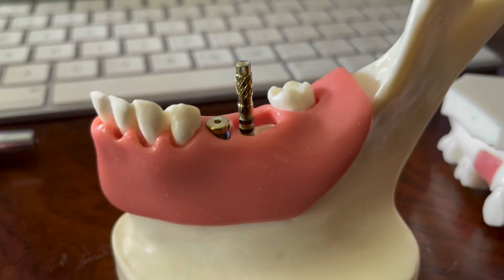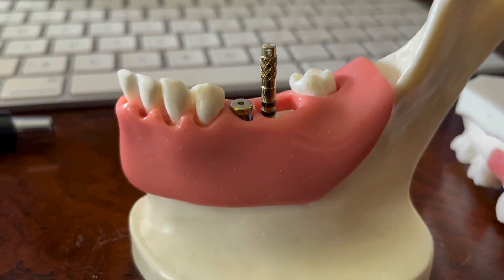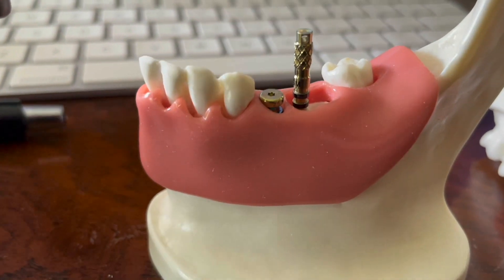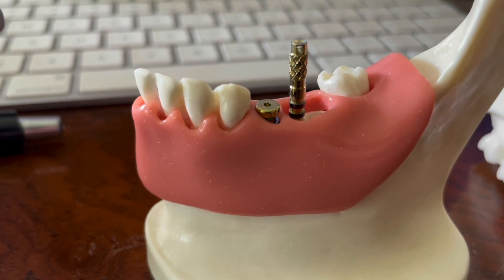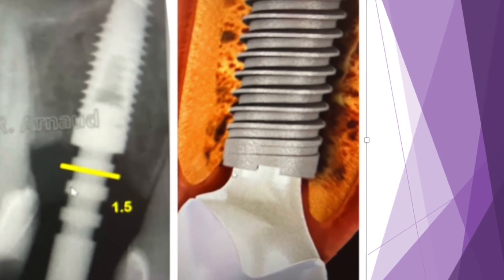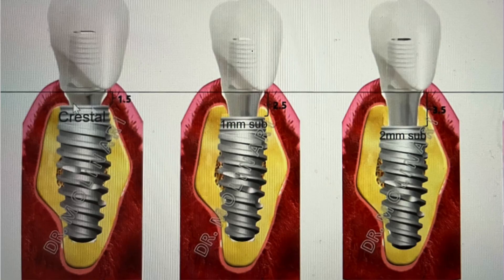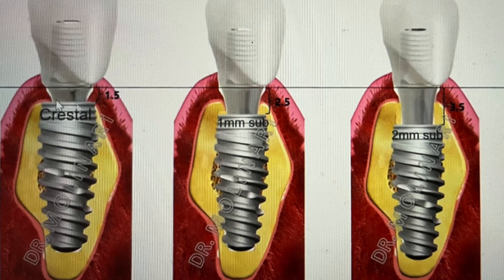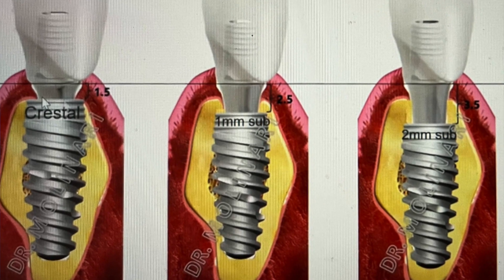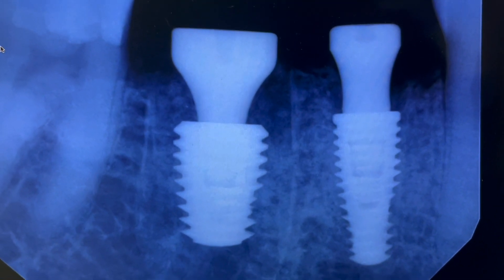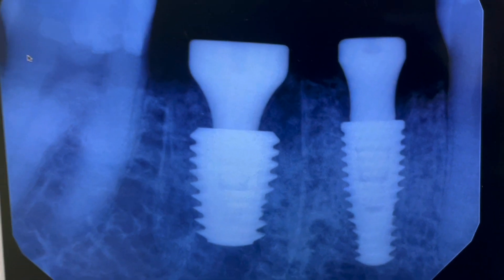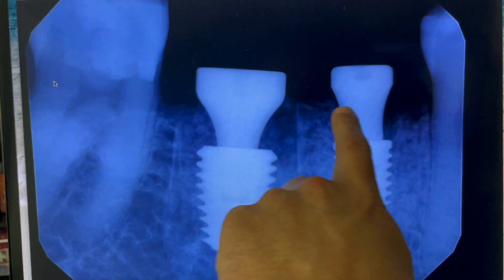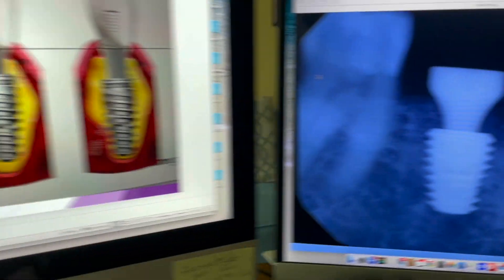Restoratively, we're just looking down on the tissue. We see the healing abutment just at the top, but it's really important to use the tissue measurement gauge and get some type of an x-ray back to our laboratories. Restoratively speaking, because the labs can't see this — they have to get some kind of x-ray to know where that implant is in relation to the bone placed sub-crestally.